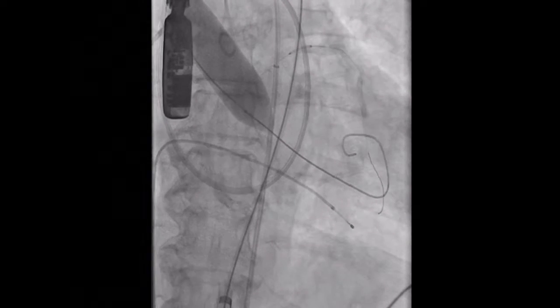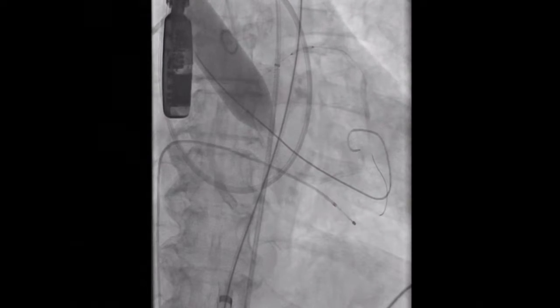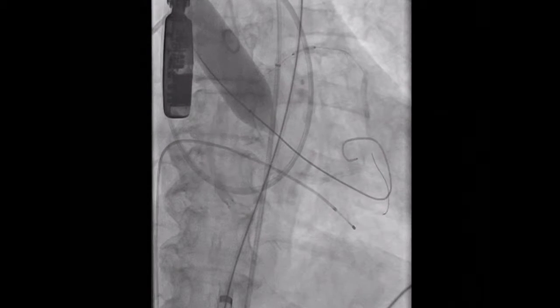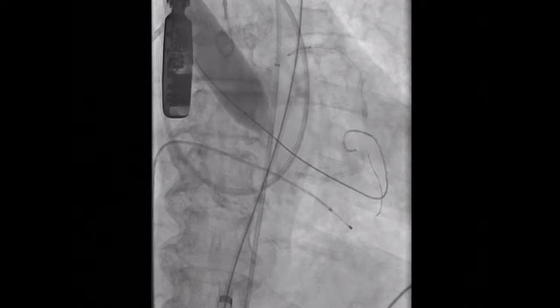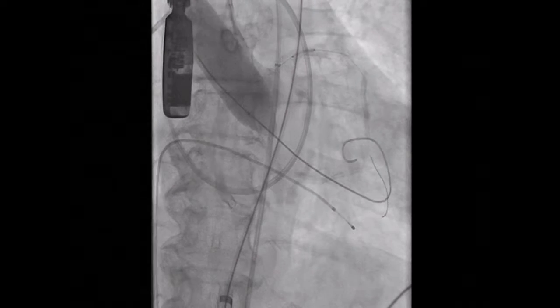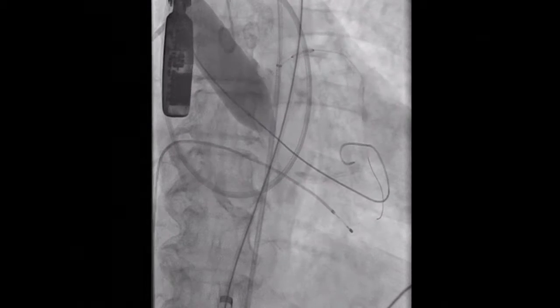So in this case, since then we have done 3 more cases, so our total is 4 cases we have done, in high-risk patients. Not every case did we do the balloon valvuloplasty and the dye, but when you do a balloon valvuloplasty, if there is enough gap, you know that even if the leaflet moves, it's not going to obstruct. But the key is that you have a guide catheter, you have the wire, and then there is a deflated stent.